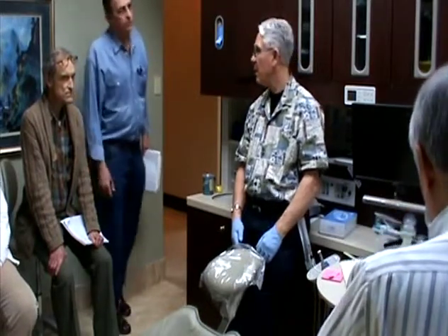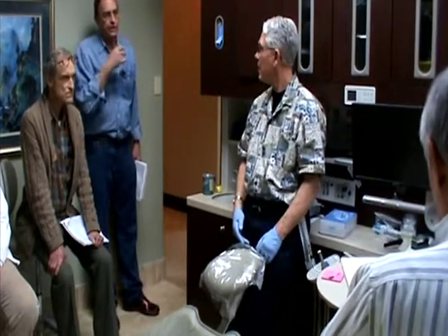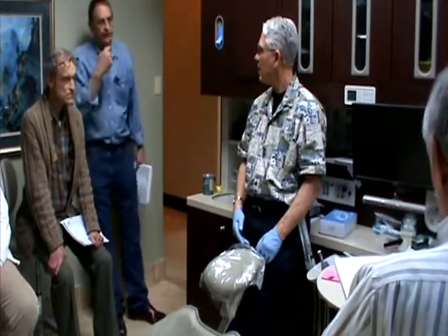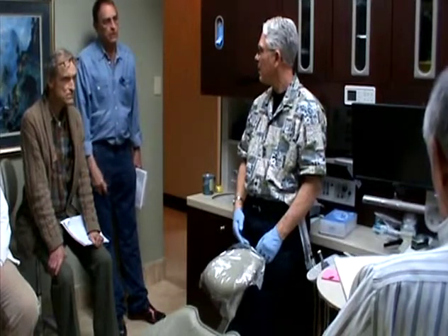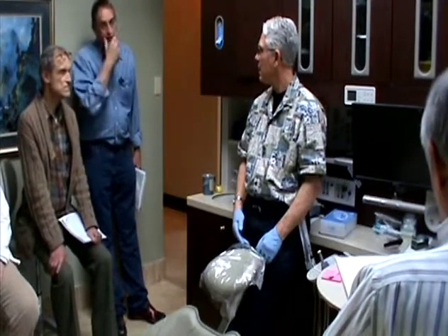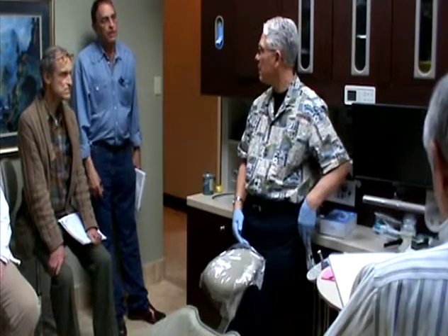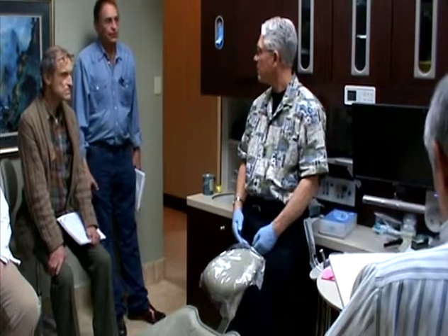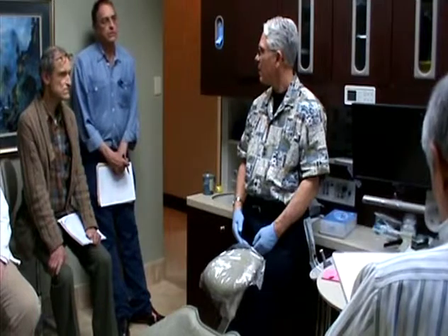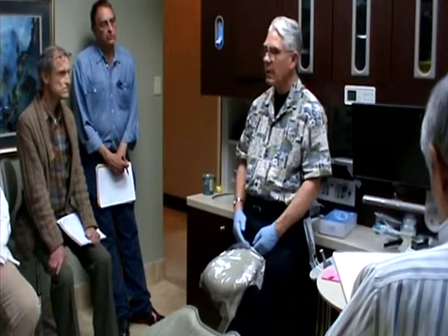Runar, why not a full arch lower appliance that includes some cuspid disclusion, you know, like you have made at the lab, and then it gives you anterior guidance also. I mean, that would work too, right? Anterior guidance, well, and cuspid disclusion, you don't want cuspid, it's only in lateral excursion. That's what I mean. It's a laboratory procedure, you're taking it to the laboratory to make the appliance. Oh, you're gonna have the lab make it? Yeah. Oh, well, I don't know anything about that.